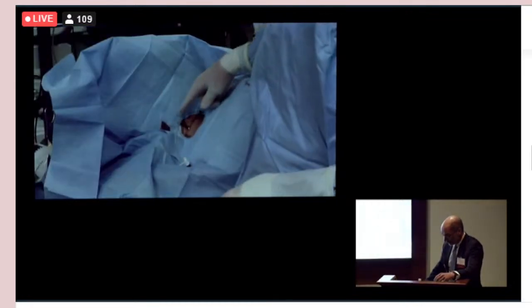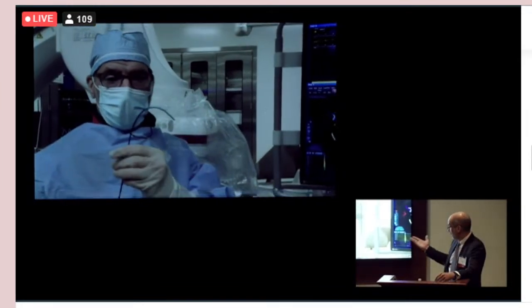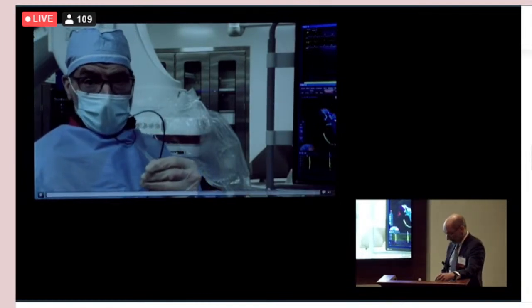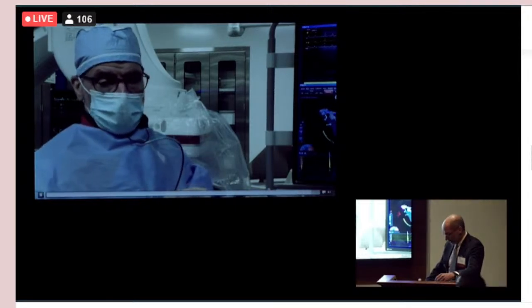And the way I like to work is all in the right side of the patient, as I would for normal work from the groin. So once we have this, we will get a regular CS sheath. I think this is Abbott's or CPS, but anyone would work, and it is simple enough. We get in the IJ with the sheath and engage the coronary sinus.